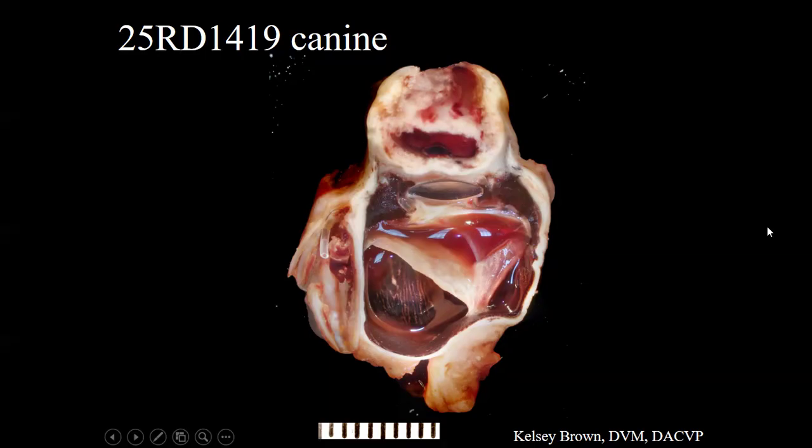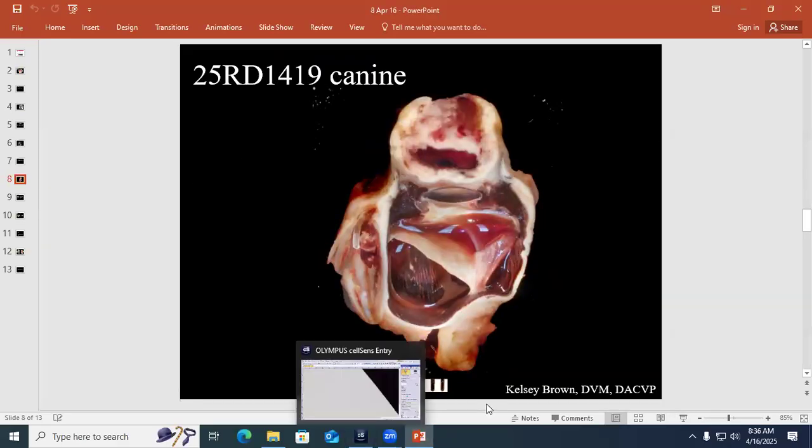Can you point out that the deep corneal stroma actually is visible and looks relatively normal? Like right here? That one. Yeah, that sort of gelatinous, colorless, opaque kind of band. It's interesting. There's a nice zone of normal stroma. So that's a good thing to point out, and it helps localize it in the corneal stroma, because some people might interpret that as just an anterior uveal mass expanding everything, but that's the cornea.